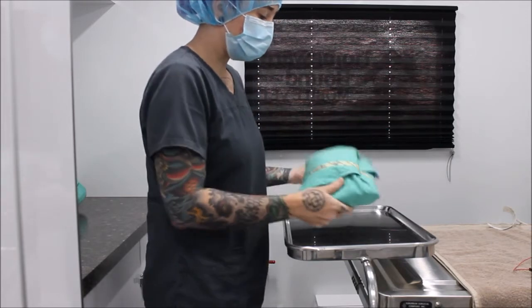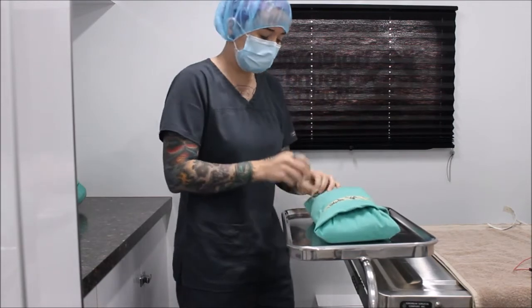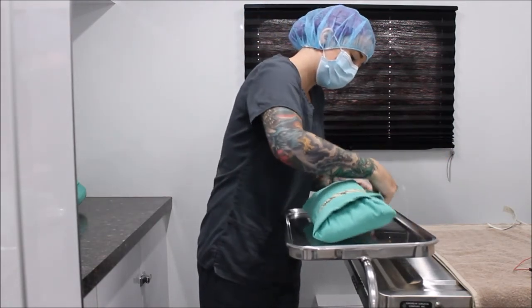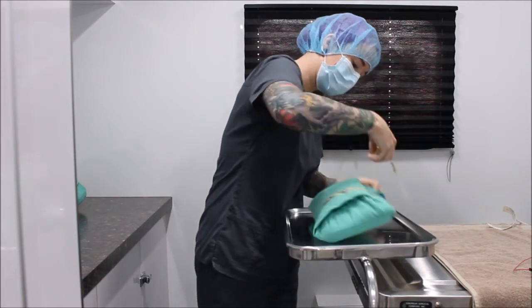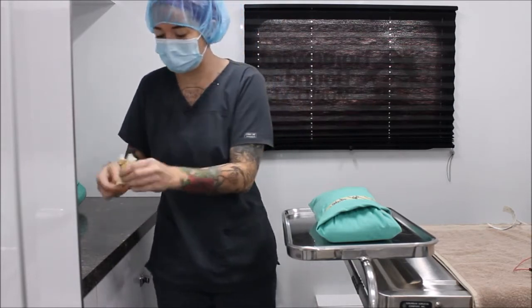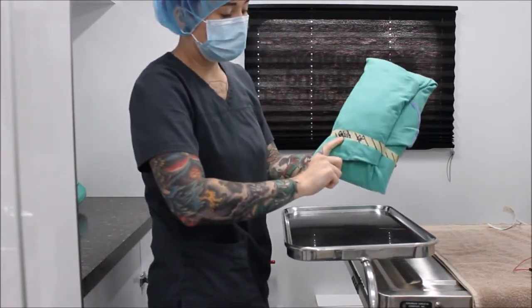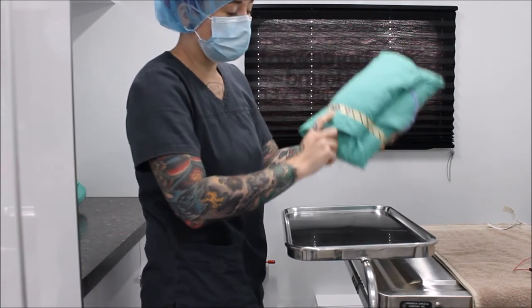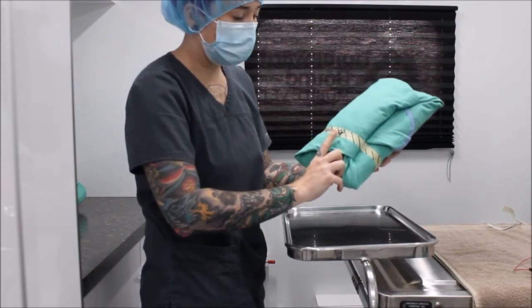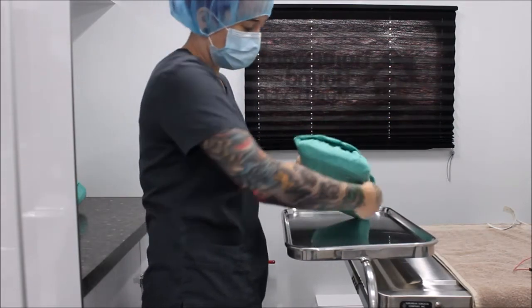The first thing I'm going to do is set my pack on my Mayo tray and go ahead and remove the tape. On my tape I can see the date it was autoclaved, which was 6-21, and the initials of the person who packed and autoclaved the pack — which are my initials. I'm going to go ahead and take this tape off.